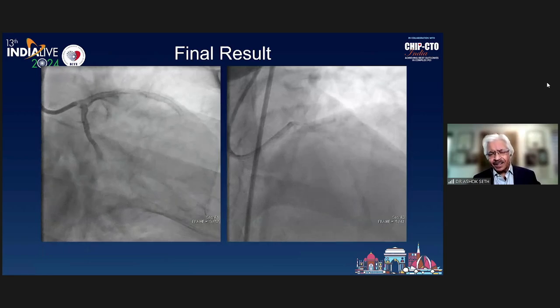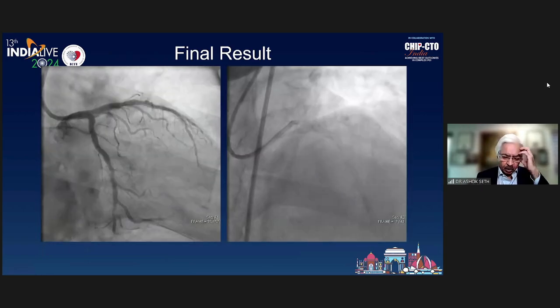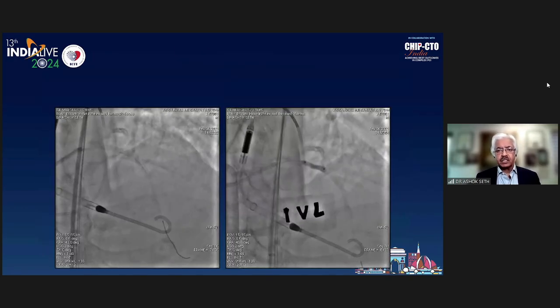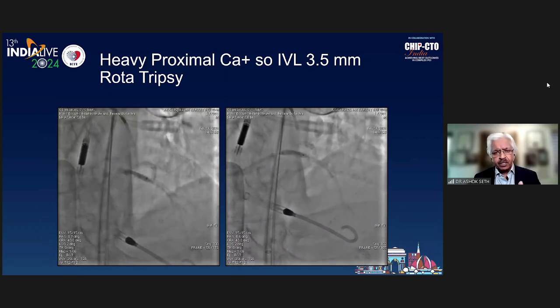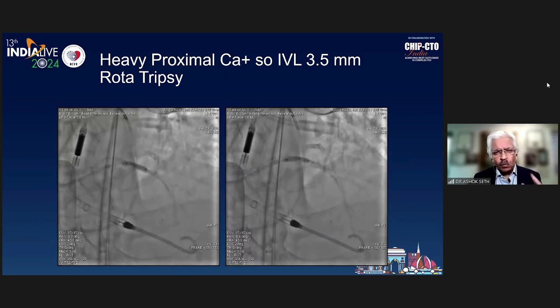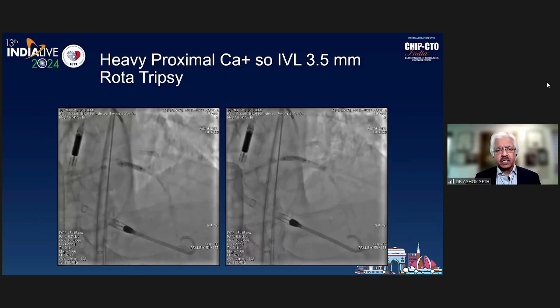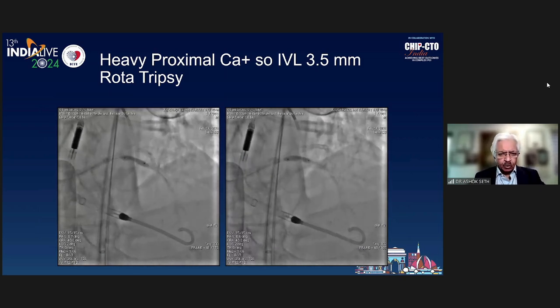So the fractures were at the extreme ends of the calcium. The thickest part of the calcium was not opening. For me, MSAs matter. For just a word about extra high pressure OPN balloons, you always need to understand the vessel size by imaging before you start using these balloons. Here's a case where I did not use imaging. Well, I would use imaging in other vessels.